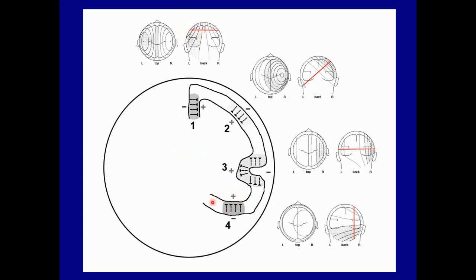If we take perhaps a more relevant source, like at the base of the temporal lobe here, pyramidal cells are again located vertically in orientation. Notice with this base of the temporal lobe, all of the 10-20 electrodes here in the top half of the head only see the positive side of the field. All the negativity is in the subtemporal region, showing why subtemporal electrodes are very important. But this is a tangential field. It is parallel to the surface of the skull, not orthogonal to it, and the source is under neither maxima but between the two.